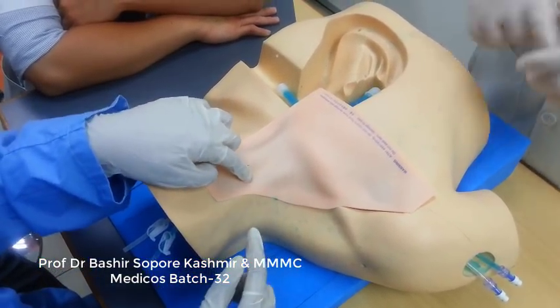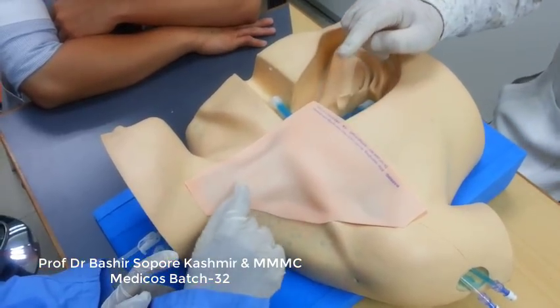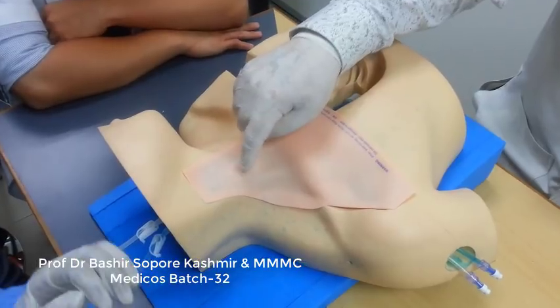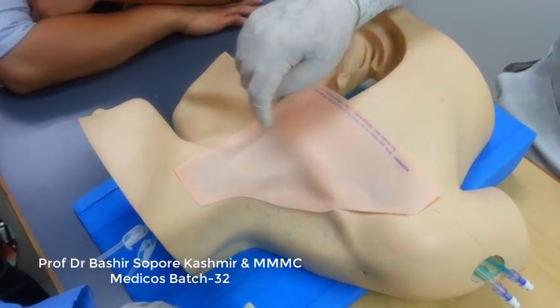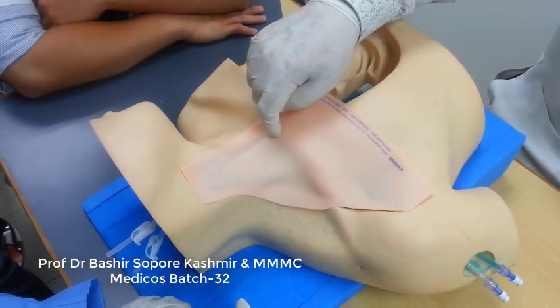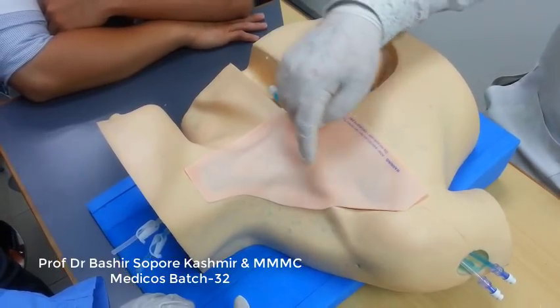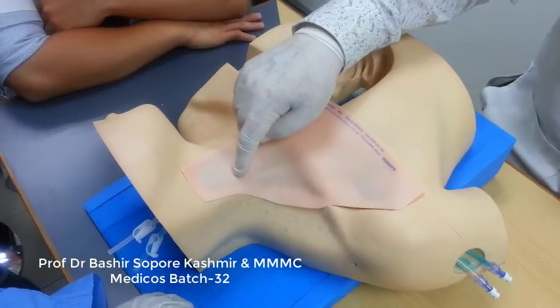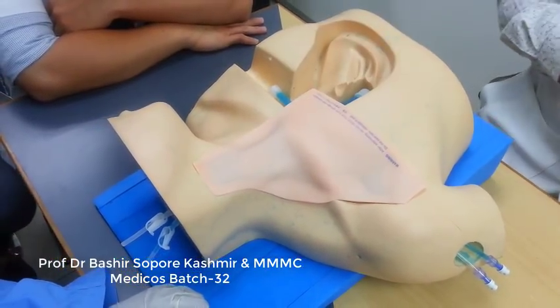Okay, so we have localized the area. For the central approach, we take the apex of the triangle formed by the sternal end and clavicular end of the sternocleidomastoid muscle. The base is formed by the clavicle, and the apex is the union between the 2 muscles. So here you will insert the needle.